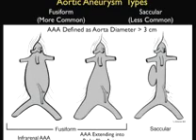This is an illustration showing the types of aortic aneurysms that may present to your emergency department. Fusiform aneurysms are definitely the more common type, as shown in the two pictures to the left, and saccular, as shown in the picture to the right, is the less common type. Let's take a closer look at the fusiform aneurysms to the left. A fusiform aneurysm is defined as a diffuse dilatation of the abdominal aortic wall. As shown in the picture to the left, we can see a diffuse dilatation of the abdominal aortic wall infrarenally located, or right below the level of the takeoff of the renal arteries.